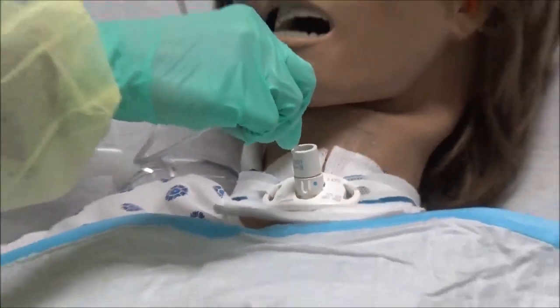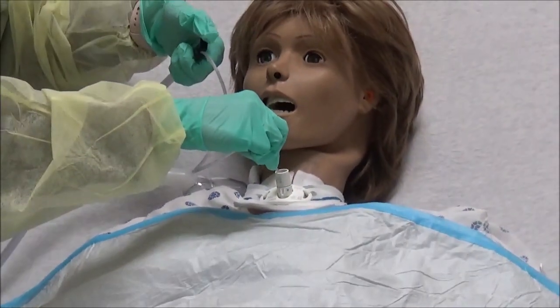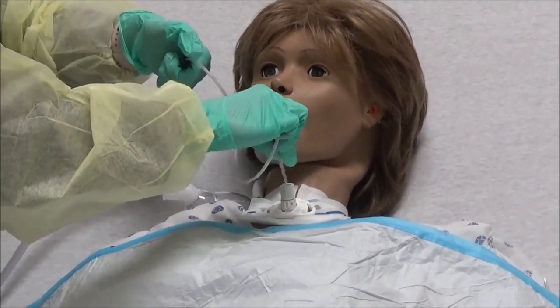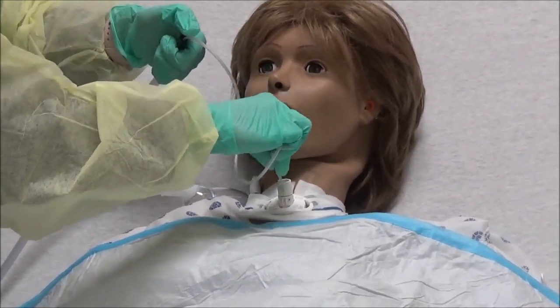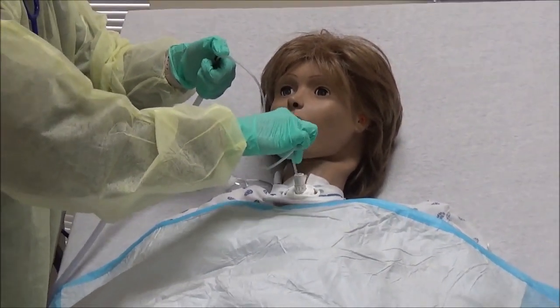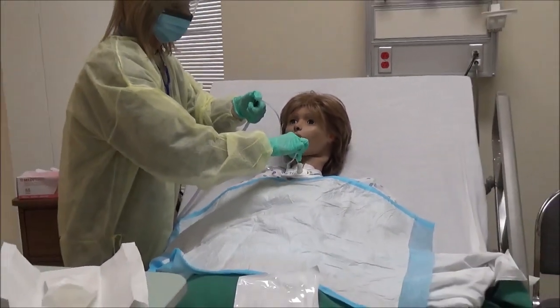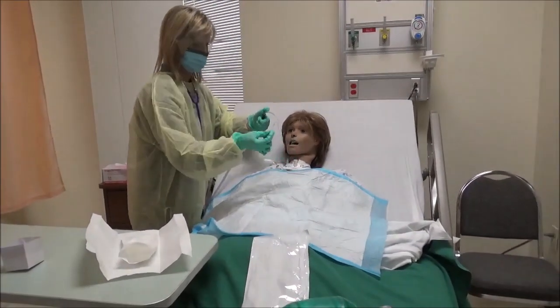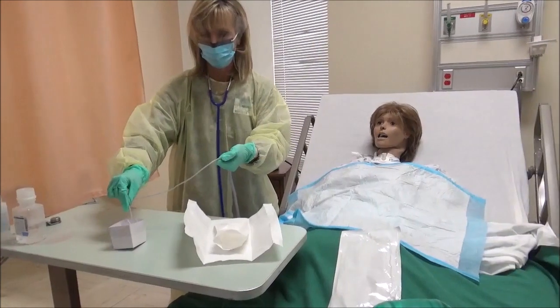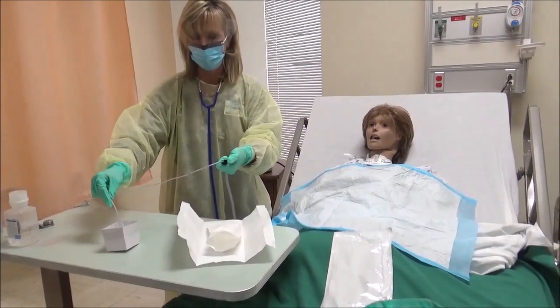When that occurs, I'm going to occlude this port and suction intermittently no longer than 15 seconds on the way out. And when I do that, I'm getting secretions out. I'm going to come real quick here and clear my suction catheter.